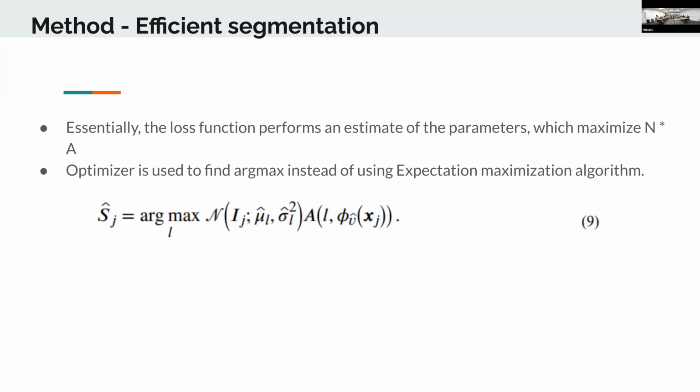In fact, I had a slide in here, I probably took it out. They only do one deformation and one network for that deformation. But in all of these other papers that I've read, they use multiple networks: the first network does a coarse deformation, and subsequent networks do more refined deformations. That might be a way to improve this method.